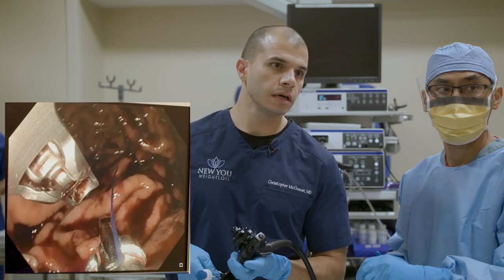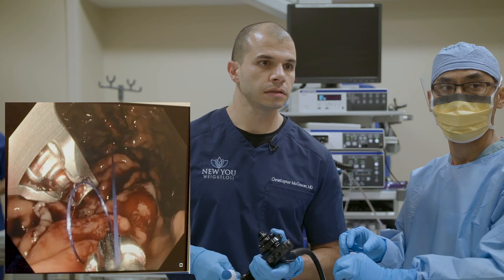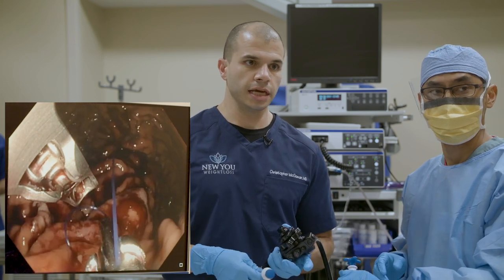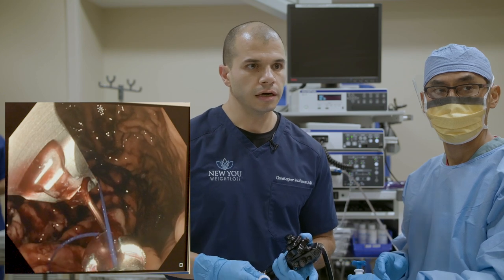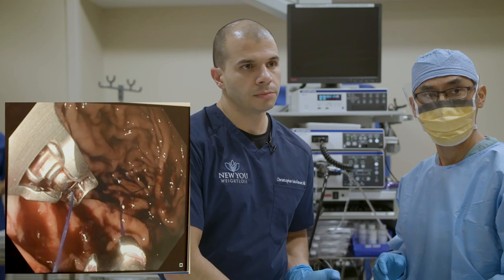Looking at this last bite — that is not a full thickness bite and it's going to pull out, so I'm going to pull that out and redo it. You can see how it pulled out pretty easily. We always have to make sure we're full thickness. No big deal — I'll just redo that one.